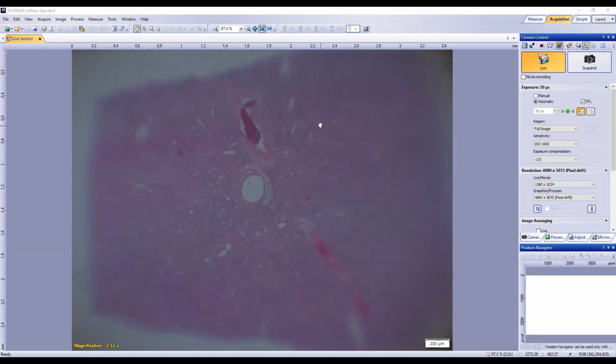From this low power view, and we're deliberately spending far more time on it than you would, certainly in an exam context, but even in a regular examination, we've gone from the picture to an overview process to some likely features that we're going to be looking for.